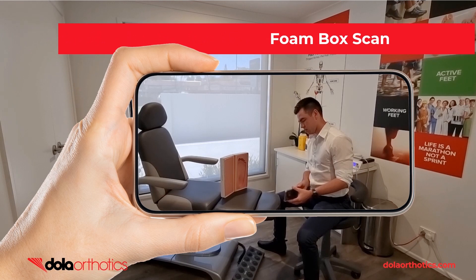Here is a demonstration of the iPhone being used to capture a foam box foot impression. Move the phone to capture all aspects of the impression including the heel, toes, medial and lateral borders.